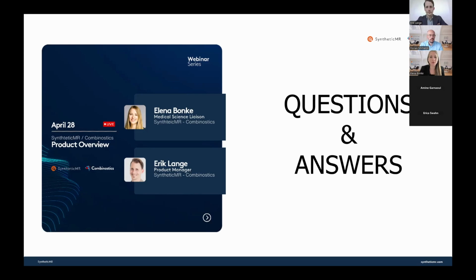Maybe Erik also has some additional comments there. How does it look on the SyMRI side? What do you think, Erik? Yeah, that's good. I'll make the question slightly larger. The question was phrased for the reporting time, but maybe I can give an overview from the SyMRI side.